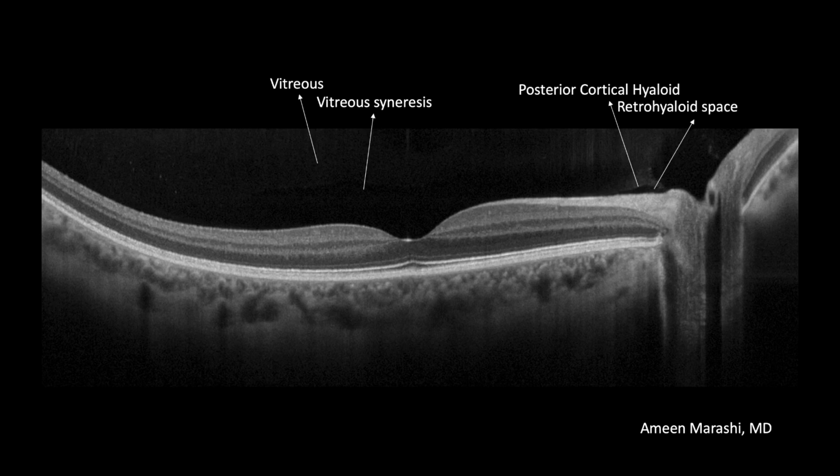When examining the macula on OCT, the retinal tissues exhibit the following characteristics: the retinal layer which contains nerve nuclei appears hyporeflective, while the retinal layer that includes nerve connections of axons and dendrites will appear as hyperreflective. Nevertheless, in spectral domain OCT, there is no visible delineation between Bruch's membrane and the RPE layer. Spectral domain OCT shows poor boundaries between the inner plexiform layer and ganglion cell layer.